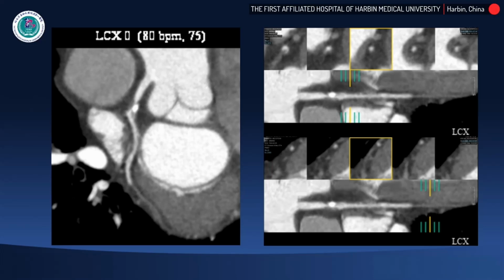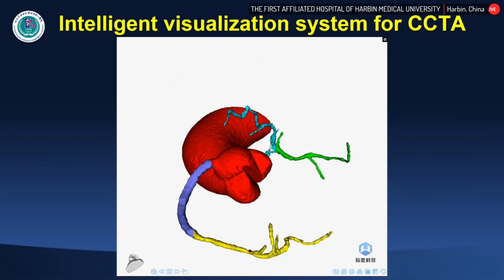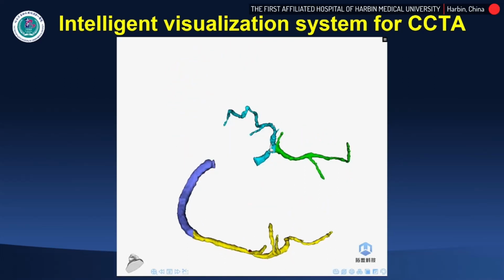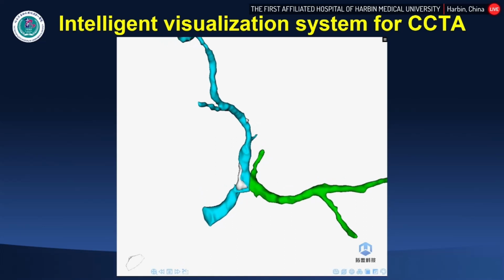Now I will introduce the intelligent visualization system for coronary CTA. We have introduced this many times. It's really a useful tool for our PCI operators.